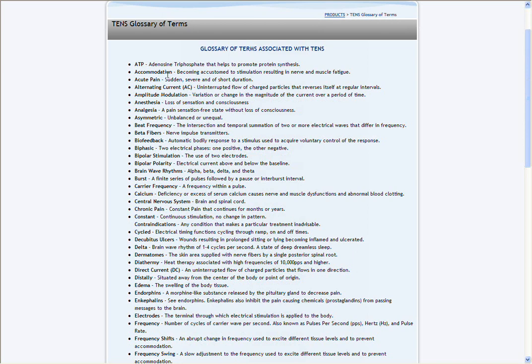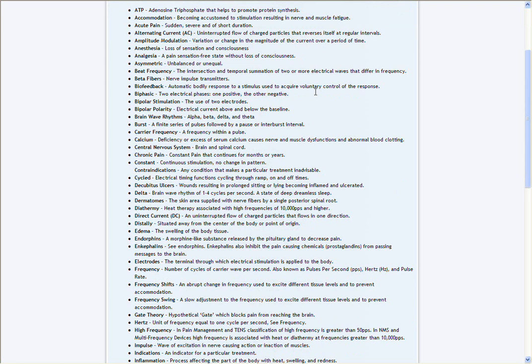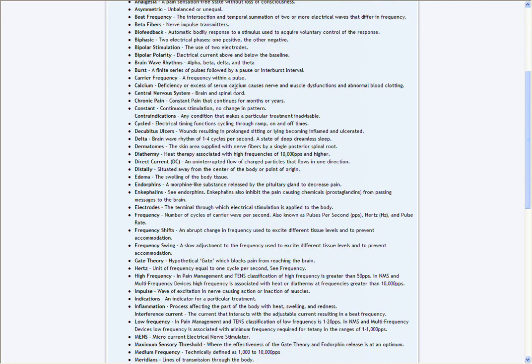Now, accommodation is something that you're going to want to avoid by having different modes, different settings, different applications and parameter settings. You can make some changes so that your body doesn't accommodate or become accustomed to stimulation, resulting in where it doesn't work as well, or your muscles fatigue. Okay, let's look down here. Cycled, electrical timing function, cycling through the ramp, going from zero to full power, totally on, and then back down to zero power and off time before it cycles again.